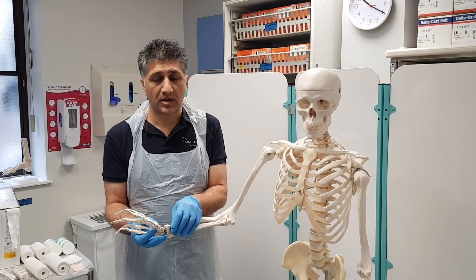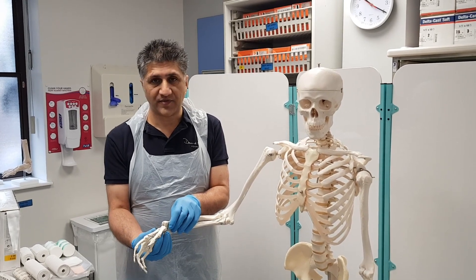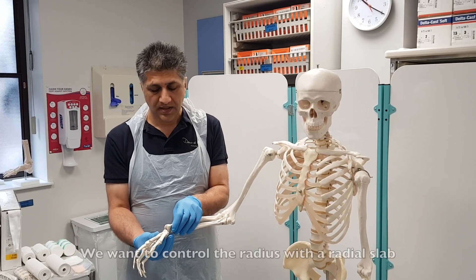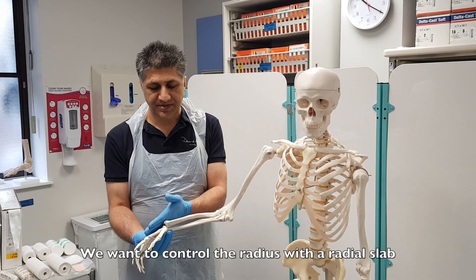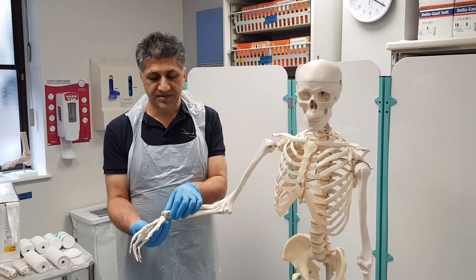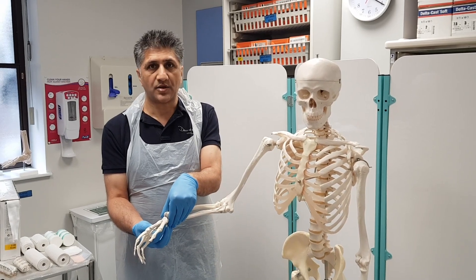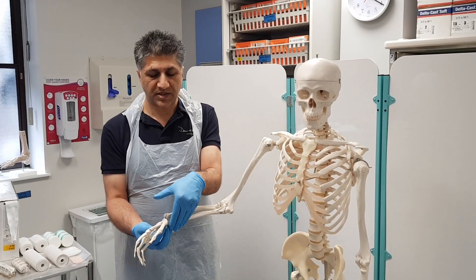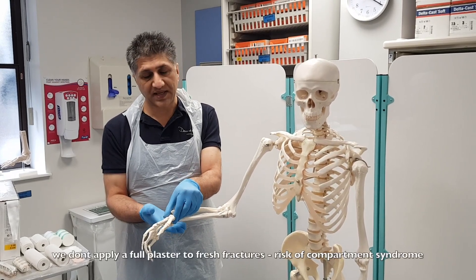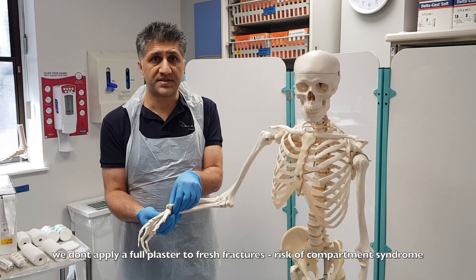When we put our plaster on, we want the hand to be in a position of reduction, which is in volar angulation and slight ulnar deviation. We don't want the backslab to be just on one side because that won't give us control. We want to control the radius, getting on three sides: the volar side, the radial side, and the dorsal side — leaving space on the ulnar side for swelling in case compartment syndrome develops.